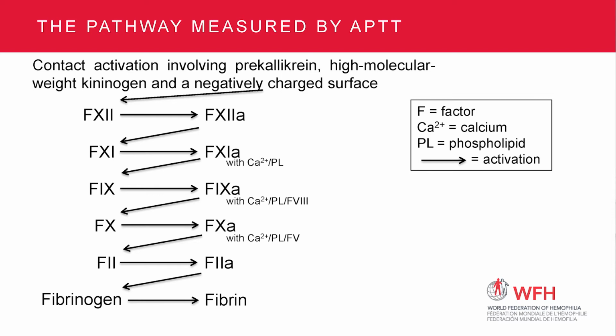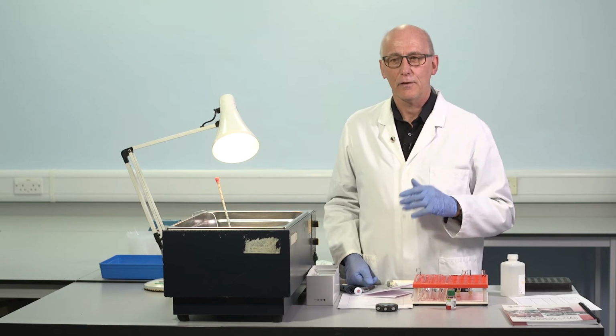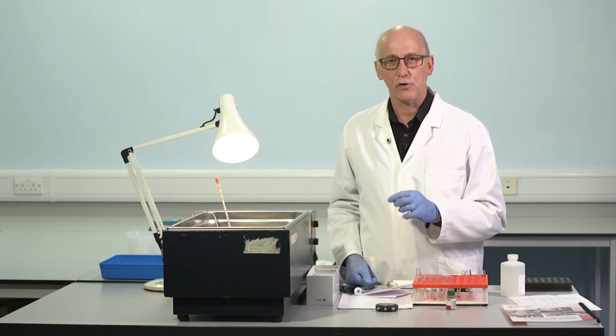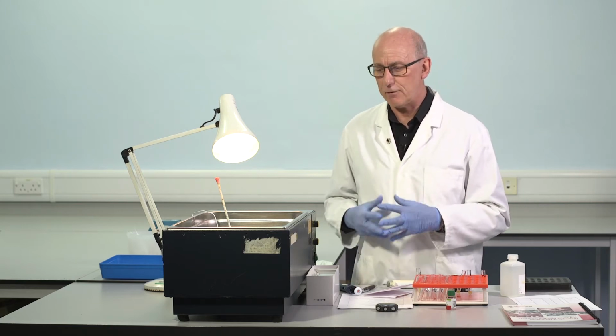For this particular reagent, 3 minutes. For some others, 5, sometimes 10. But important to use the manufacturer's recommended activation time, and very important to carefully control this so that we've got the same activation in each tube, the same activation period, the same for patients, the same for QC materials.